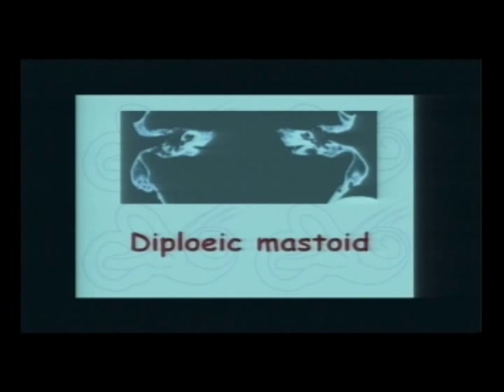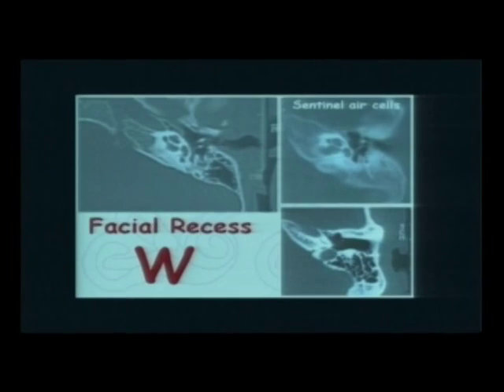So how to protect yourself from injury in the sigmoid? Use a large burr. Always when you have a large cutting burr, you find that you're going to run on the sinus without injury. If you're using a small burr, you're going to puncture the sinus. So always use a large cutting burr when you find that you have a diploic mastoid.